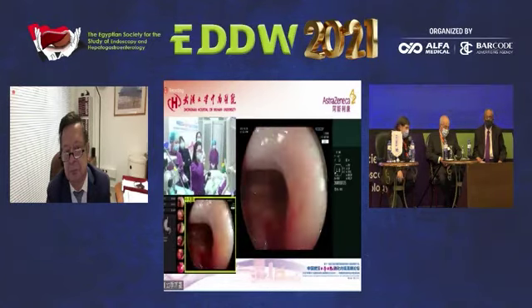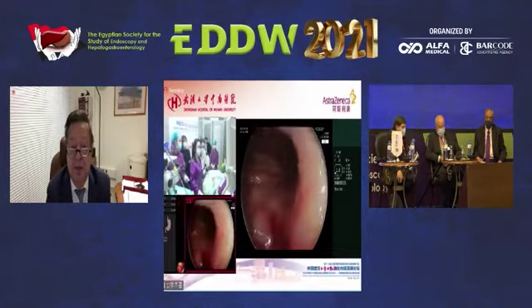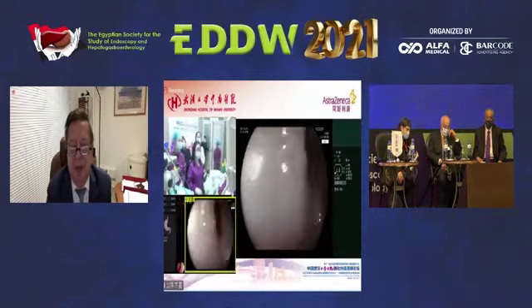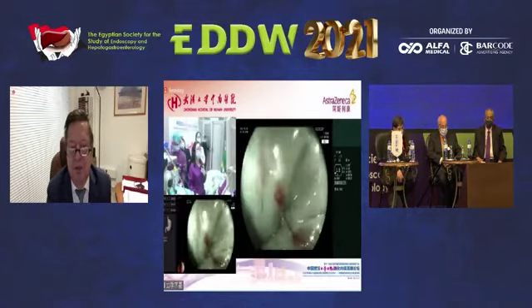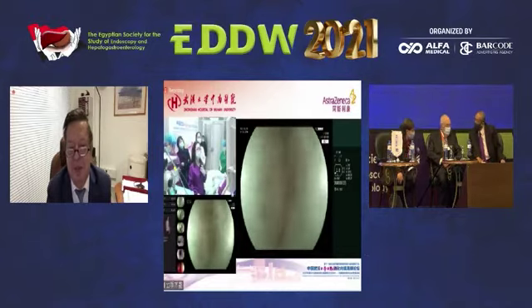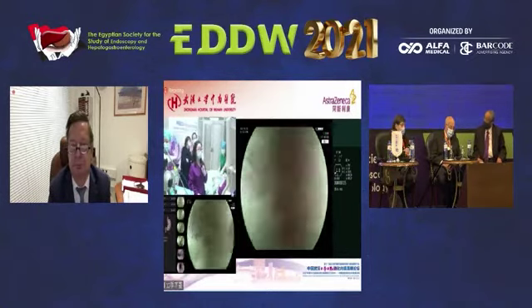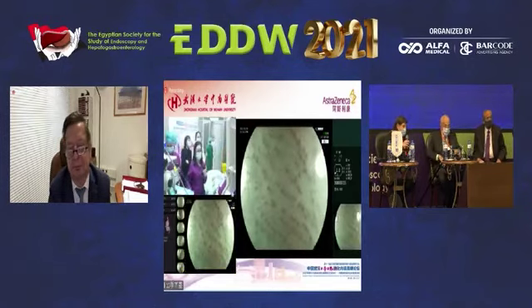But Dr. Francois, don't you think that using artificial intelligence stops the human brain from thinking? Oh, yes, of course. What is important with artificial intelligence is that it gives you more accuracy, because we have had excellent endoscopes for the last 10 years, and sometimes people don't use them properly and miss the correct use of LCI, NBI, and so on. Artificial intelligence will increase your accuracy and give you a better overall endoscopic quality.